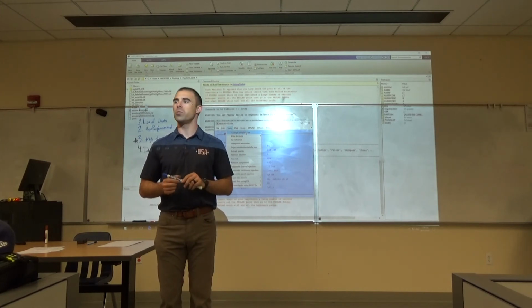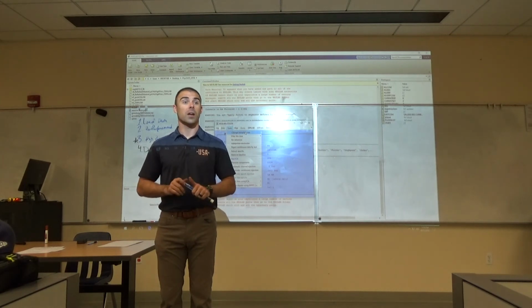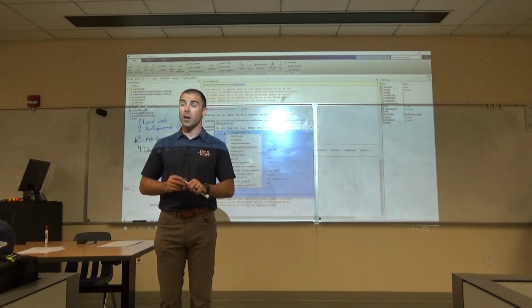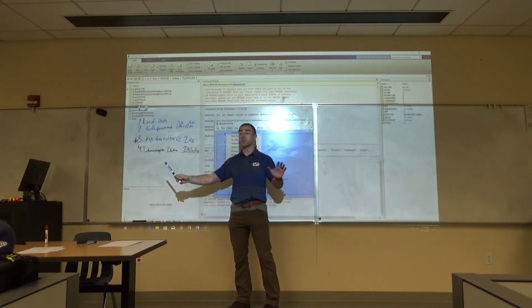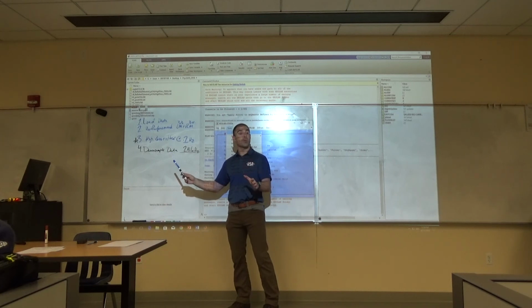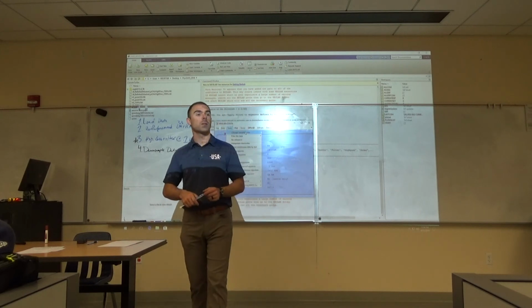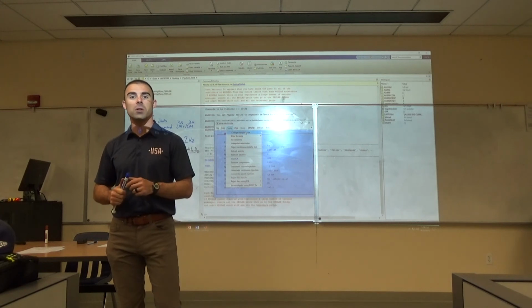And when we do that, please have all the files that we talked about downloaded. Please have Matlab loaded, EEG loaded, your path set, and hopefully import that BDF, number 41. Do exactly what we did, average to the 33 and 34. Do the high pass filter at 0.1 hertz. If it crashes, reboot it. It looks like it will work then. And in 10 minutes, have it ready to go at this point for our change sampling rate. And I'll come around, we'll help you guys get on track. Does that sound good? Okay, cool.